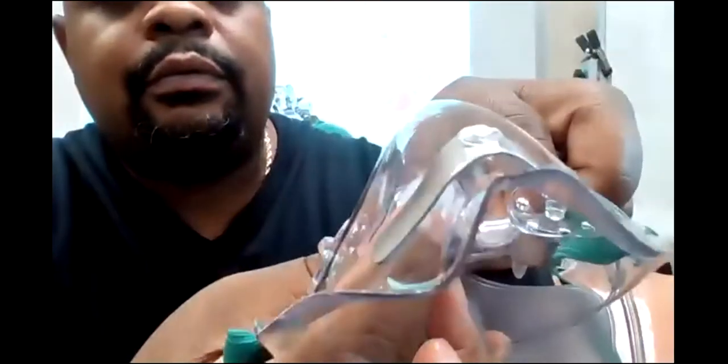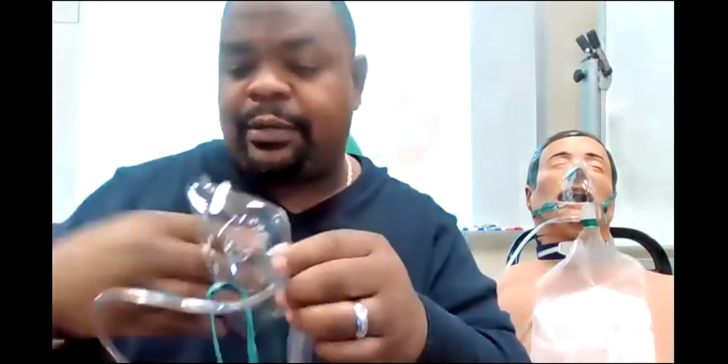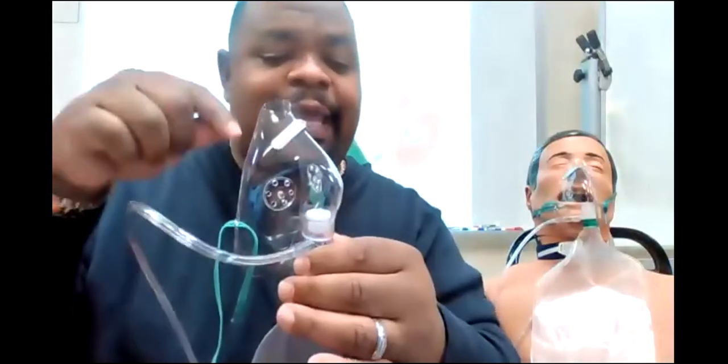There's a little piece of plastic right there. Okay, that is a one-way valve. It allows oxygen to come from the bag, but it will not let me push my air into the bag. That's the trick. When I exhale, my exhaled gas goes out of the sides only. It does not go into the bag. That's why it's a non-rebreather. Because if I can't push my air into the bag, that means I'm not going to rebreathe my own air. The only gas the patient is getting is the source gas.